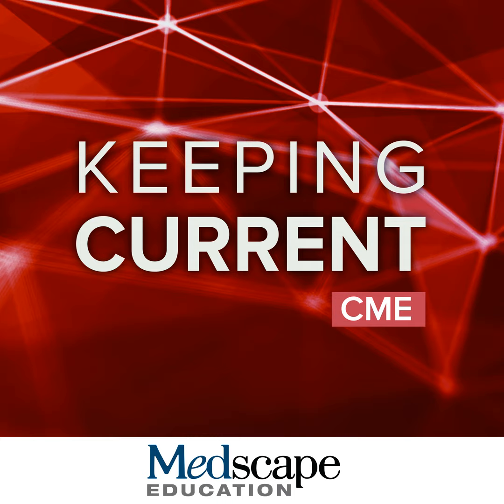Thank you, Dr. Cherniak. It's a pleasure to be here. So just some background about the use of LIRADS. A lot of us are using LIRADS in clinical practice, and we always come up with indeterminate liver lesions or observations. Typically, those are classified as LIRADS 3 or 4. These are typically intermediate probabilities of HCC development with variable risk. They do exhibit some characteristics, but not all characteristics of HCC on CT or MRI.